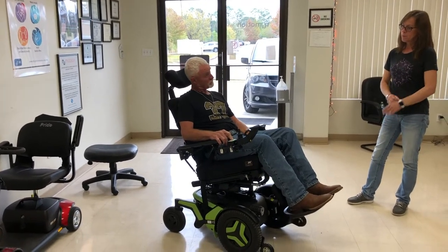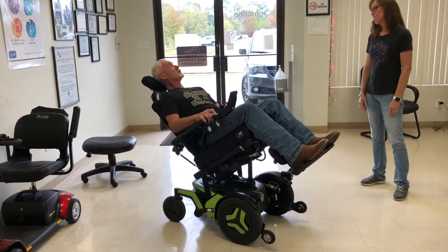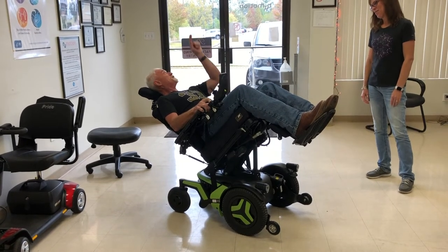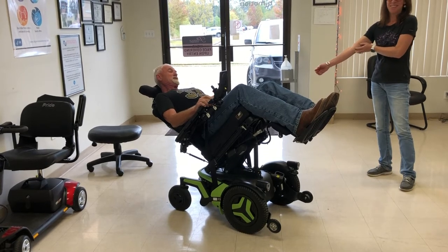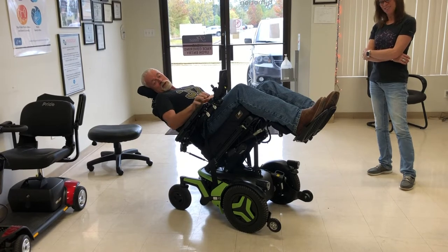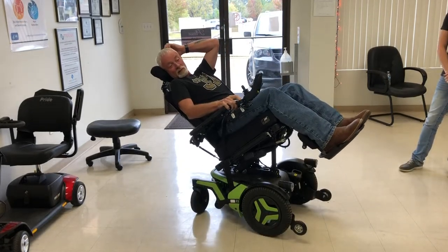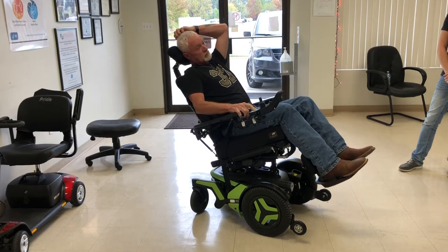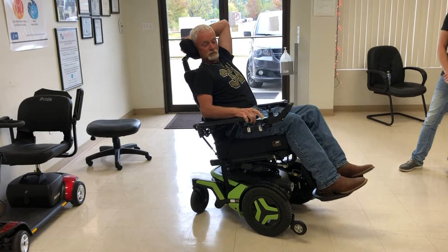Go as far as you feel comfortable — you've got the headrest back there. There you go — you could watch the moon from up there! You could drive the space shuttle — that's how they have to sit, just push the buttons on the ceiling. That's your tilt feature. You want to do that for pressure management — taking that pressure off your butt and putting it onto your back. That's the best thing for pressure relief.